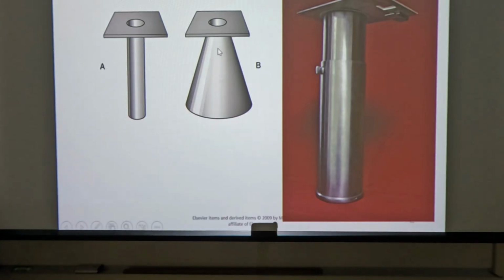Extension cylinder, cone, that's just a static cylinder. These things right here, I can tell you from experience, if you're ever working anywhere where they routinely use these, and you probably will not, but if you do, make sure the thumb screw is screwed down before you grab the base part of the cylinder and turn it over, because you will get a blood blister whenever this slides down and pinches your finger. They're heavy, not prohibitively heavy, but they're heavy enough that they'll bite you.